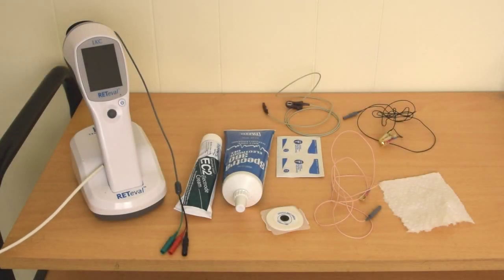Prior to running a flash VEP test, make sure you have all the necessary equipment. This includes the Radeval device, designated electrodes, and any patient preparation materials you require. When you have all the equipment and supplies, you are ready to run the test.